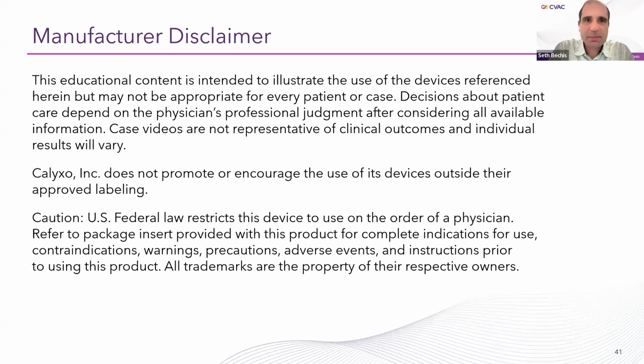We've just been part of a study that found that even if you put in a ureteral access sheath in a well-selected patient, you can leave them stent-free, and they do fine. There's no increase in post-operative complication rates. That's data we presented at the AUA this year. So I think that paradigm is shifting, and especially if a patient is pre-stented, putting up a 12 French ureteral access sheath should not be a problem.